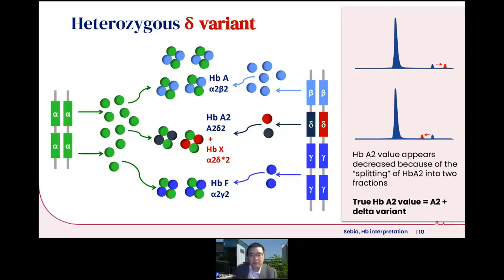Once again, the change can affect the chemistry in either way, so it can shift the peak to the left or to the right. However, because hemoglobin A2 is important for diagnosis of clinical situations like thalassemia, to consider the true hemoglobin A2 value, it's important for us to sum up the percentages of the 2 peaks, even though one of them is the variant.